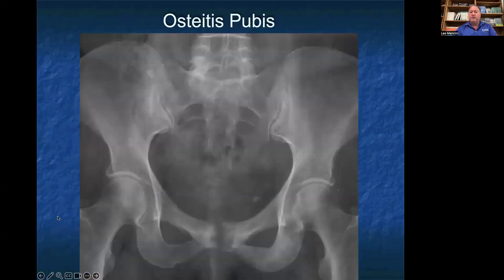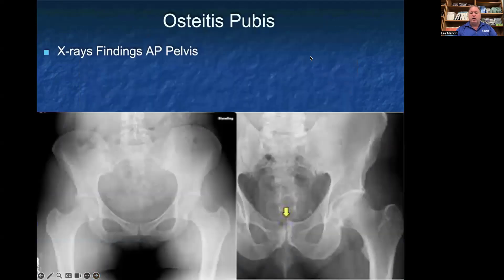Our third and final clinical case for common hip x-ray findings is osteitis pubis. Osteitis pubis is increased sclerotic changes specifically around where the two parts of the right and left pubic bones meet, on either side of the pubic symphysis. On the left you can see a normal AP pelvis view with normal healthy pelvic bone, and on the right, where the yellow arrow is pointing, you can see increased sclerotic changes and irregularities — the bone is much more bright white.